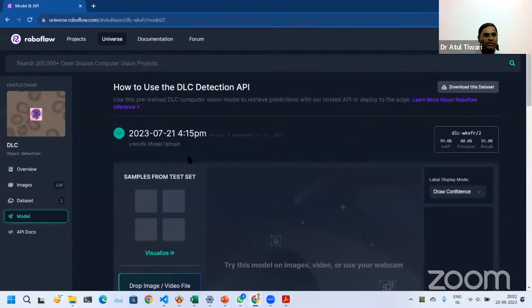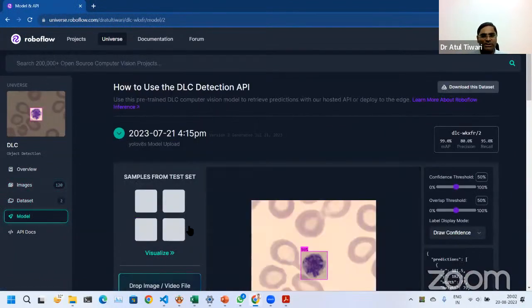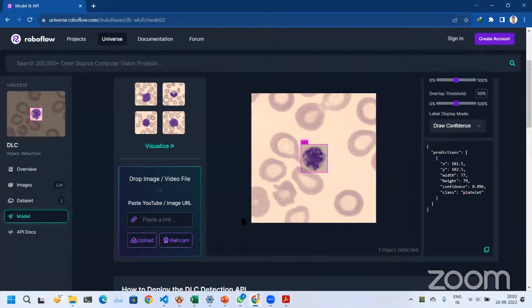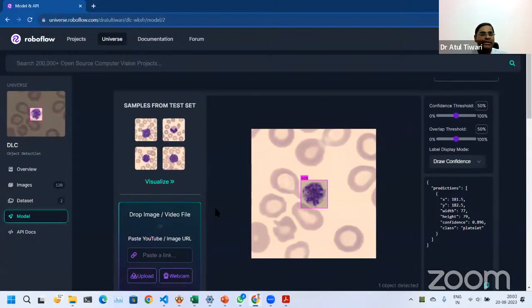Okay, let me show you. This was a model that I created some time back. It was created with the intention to predict all WBCs, platelets, blasts and all those kinds of things. My aim was to create a model so that even if there is a single blast on the slide, in subleukemic or aleukemic leukemia cases, if I submit my slide to the model, can it predict it? That's how we can use it in daily life.